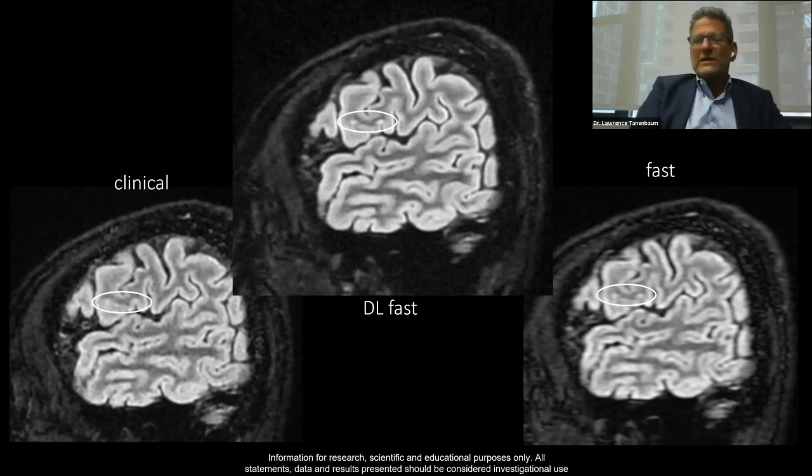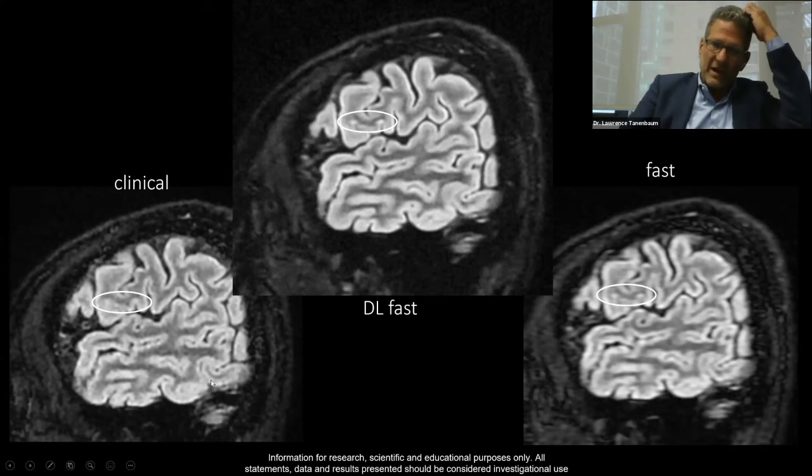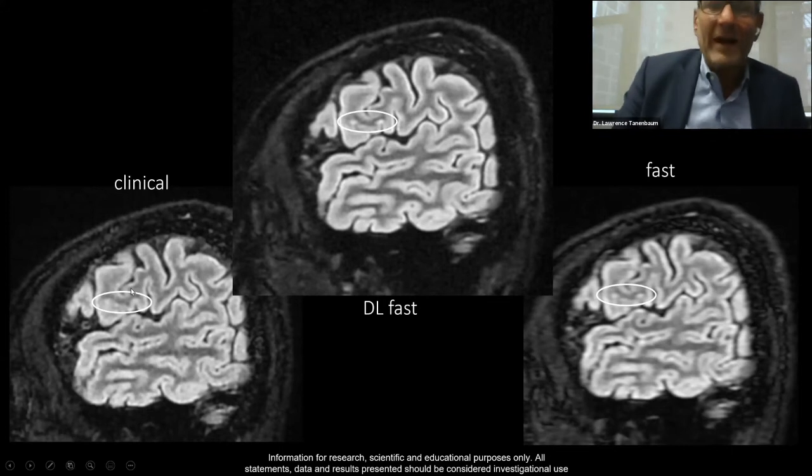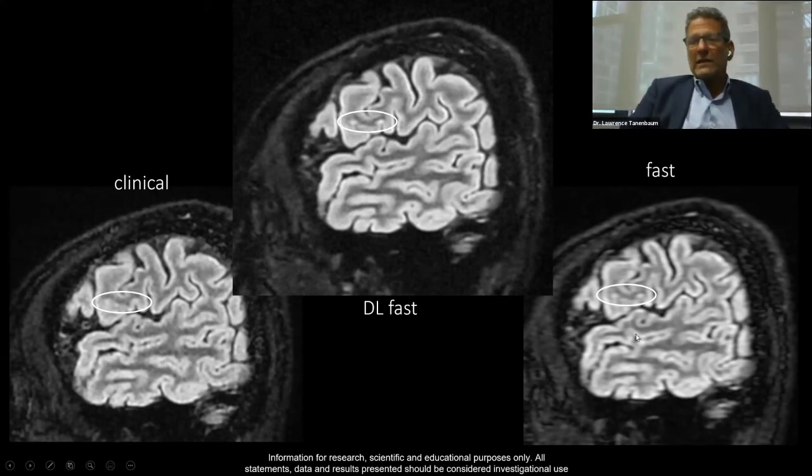In general, as we start to push higher and higher in resolution, we tend to lose a little bit of our contrast to noise. As a matter of fact, when you look in this circle here, even though I tell you there's a couple of white matter lesions in this circle, you'd have a hard time finding it. Now, when we go to the lower resolution version with bigger voxels and higher SNR per voxel, notice that we do see two lesions here in the circle. Now, admittedly, these aren't exactly the same position, but it's a pretty good correspondence.